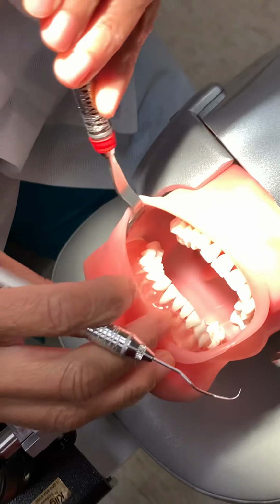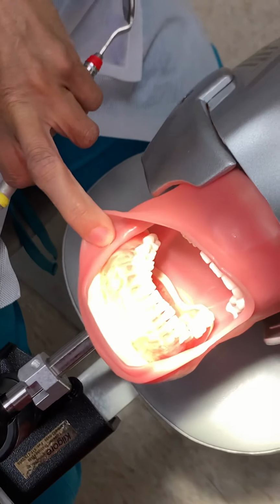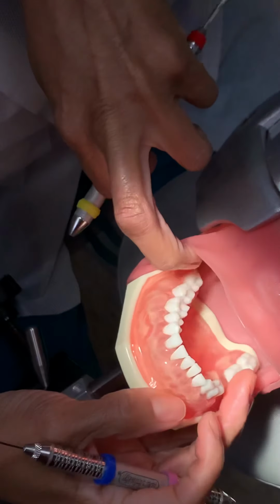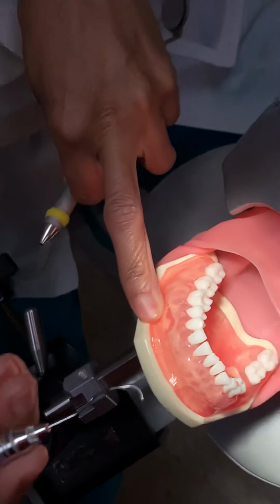Okay, so I'm going to talk to you about the Explorer that Ms. Grooms lectured on yesterday, and this is just to reinforce some of the things that she talked to you about in lecture. I'm going to pull the cheeks back there so you can see. First thing with the Explorer, this is the 11-12 Explorer.